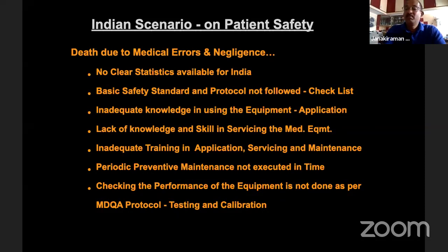And when the equipment fails, you see it fails on a patient. And if two or three equipments fail at the same time, there is a disaster. So we do not do preventive maintenance.